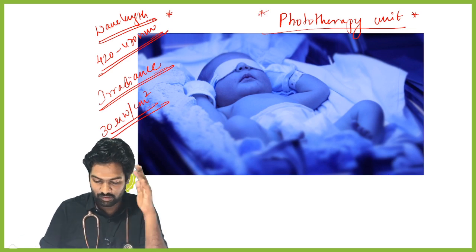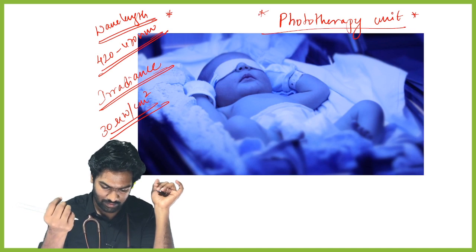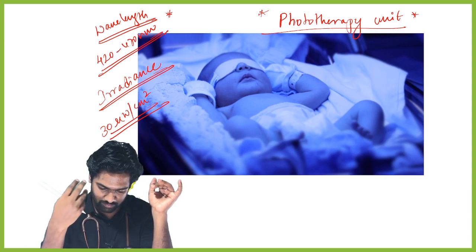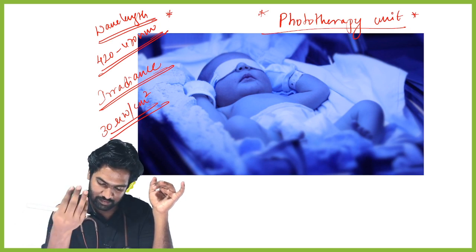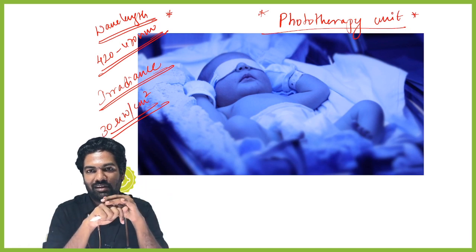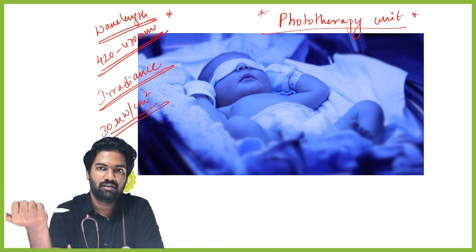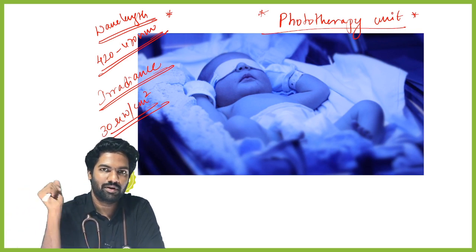What other questions am I expecting here? Another thing I want to tell you. Now wait, let me put it like this. By what mechanism does the phototherapy unit decrease the bilirubin? Or better put, what is the most common mechanism in the phototherapy unit to reduce hyperbilirubinemia?